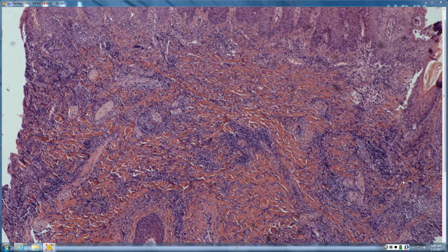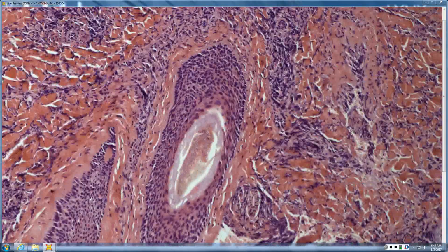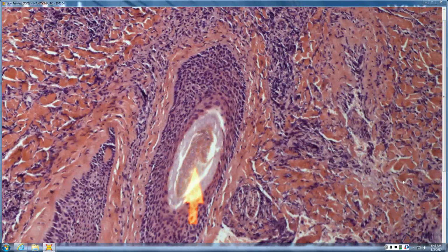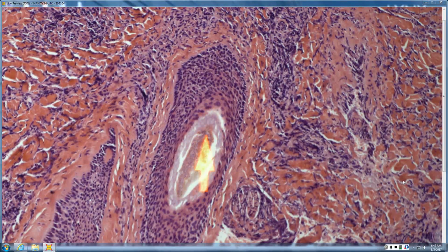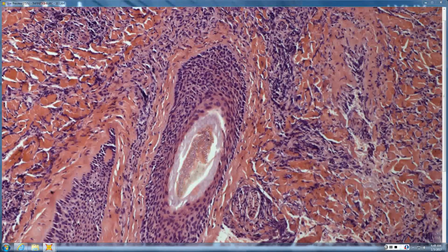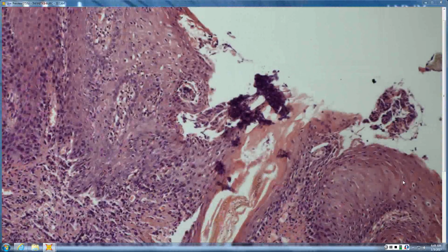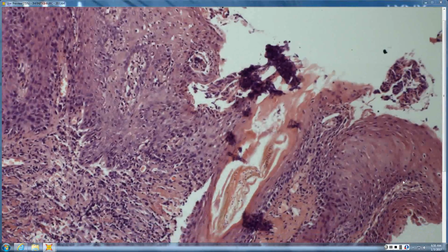And so, getting a little bit closer is where you really start to see the hyphae and spores and whatnot. In this case, it is endothrix, so it is actually inside the hair shaft, and then of course that goes with different mnemonics of memorizing what strain of dermatophyte it could be. You can see it up here in this follicle as well. So that is a Majocchi's granuloma.